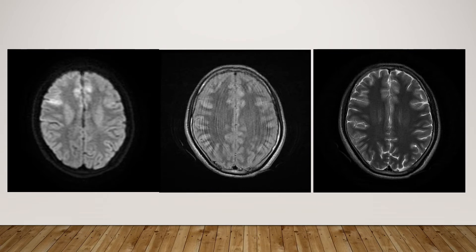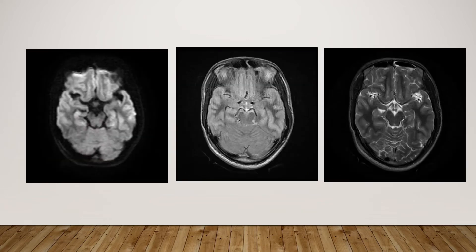In this image also we can see areas of restricted diffusion in bilateral frontal parasagittal cortex as well as the frontal cortex. The white matter is relatively spared. In these images we can see that bilateral hippocampi are also involved. The cerebellum is spared and the brainstem is also normal.